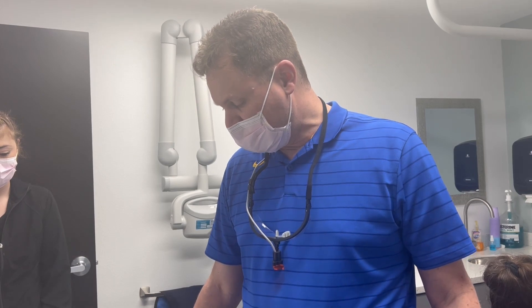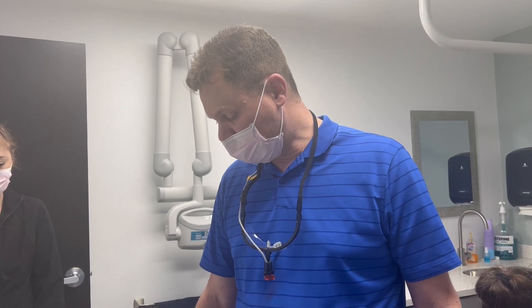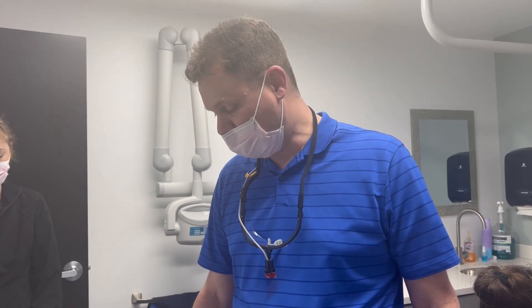The challenging portion of this procedure is having your hard reline material go around and lock your locators into the denture without locking around the implant itself. To mitigate that difficulty, first we're going to put in escape holes for the hard reline material, and second we're going to use light body as a way to block out our undercuts.